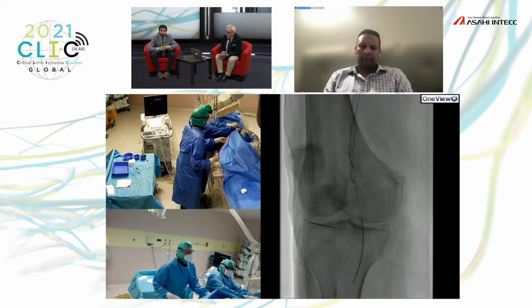The impression is that the resistance of this tip is higher compared to most of the CTO wires, where you have the tendency to have a break, to have damage in the tip, and many times there is the risk to lose the very, very distal part of the tip of the wire.